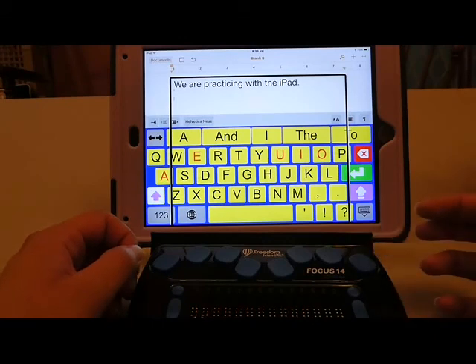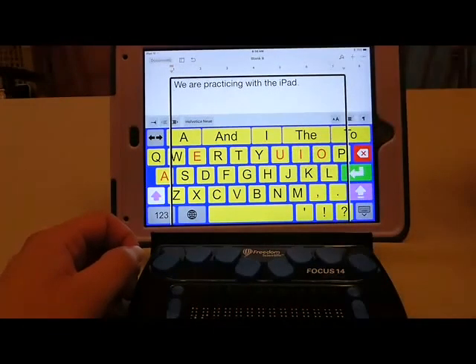And that gives you a quick summary of how the Focus can interact with the iPad. Please read the article to hear even more ideas about how to use it effectively.